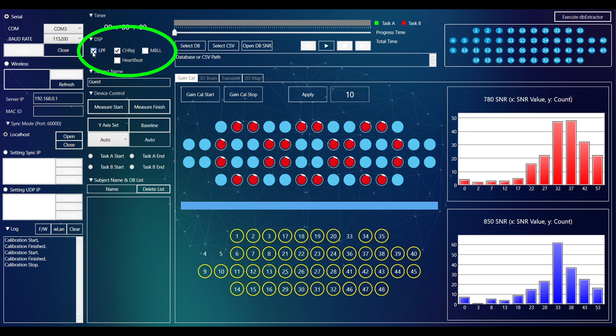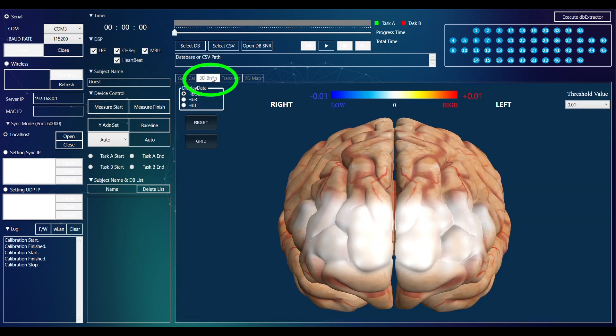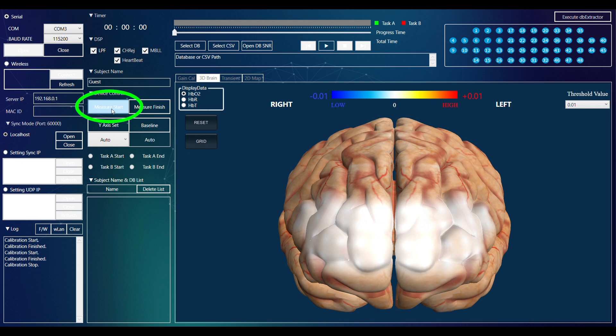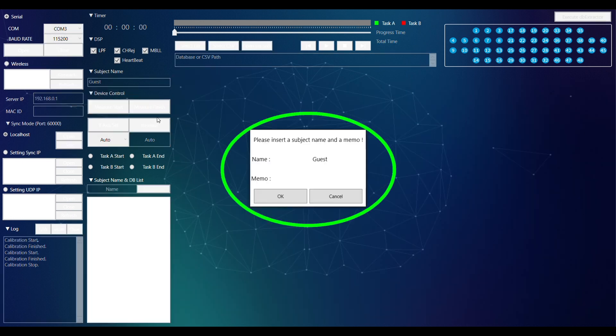To start measuring, select the relevant DSP, change to 3D Brain Mode, and press Measure Start to start recording. Insert the subject's name and memo.